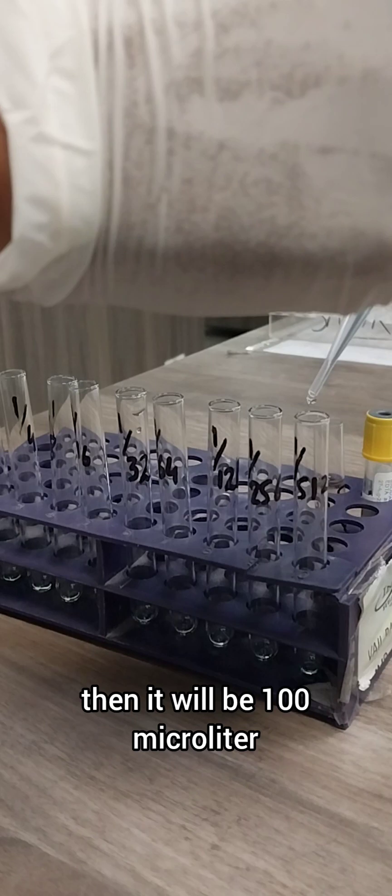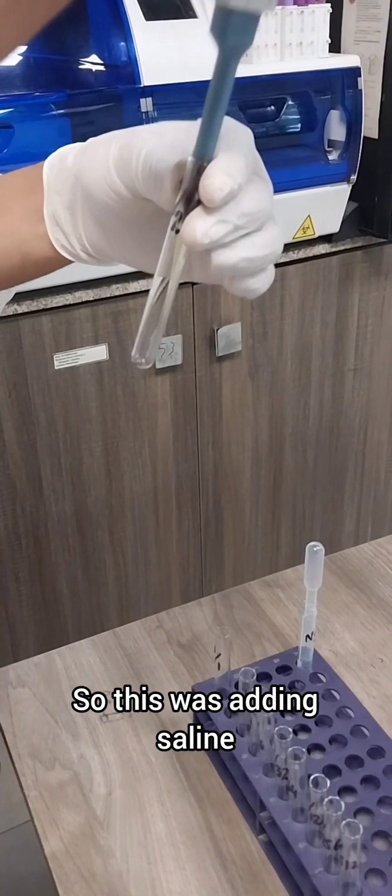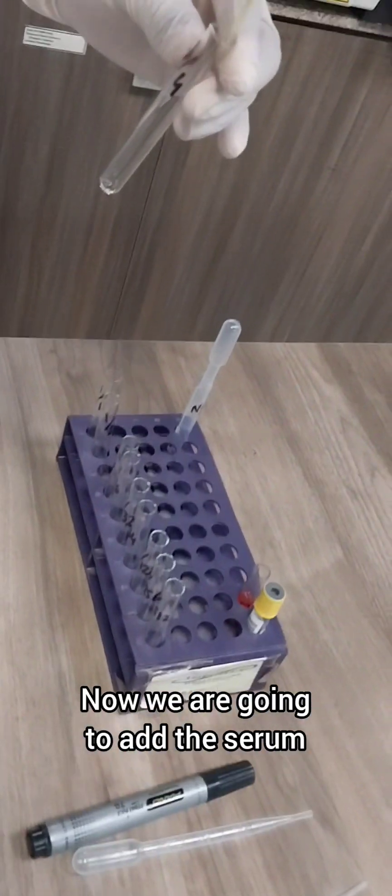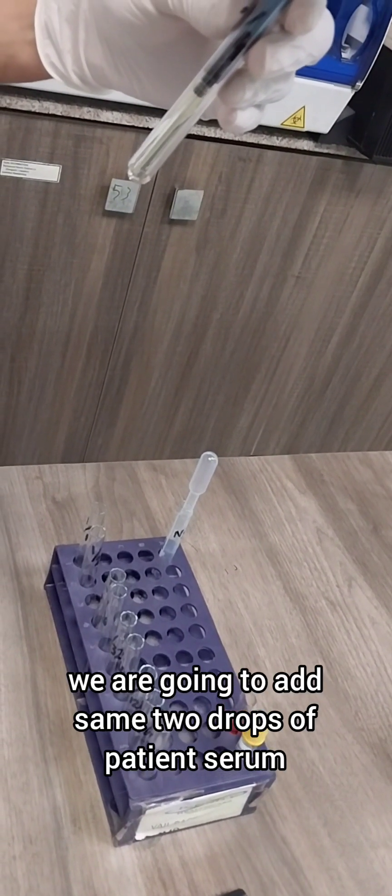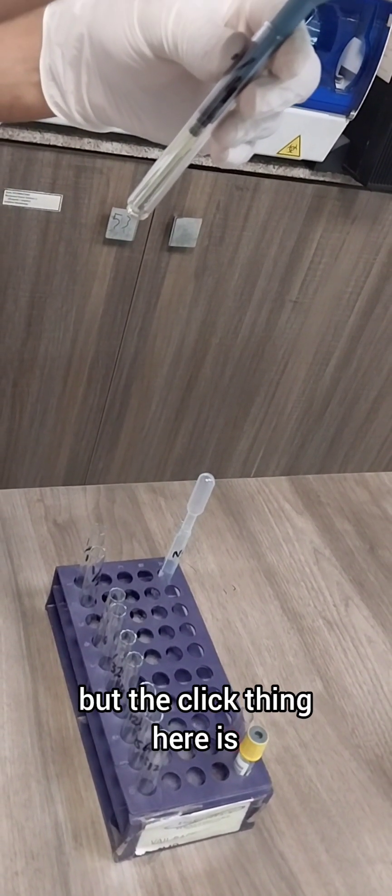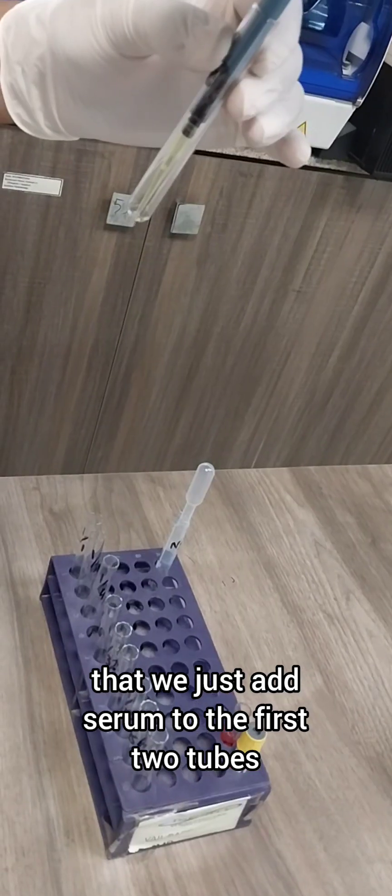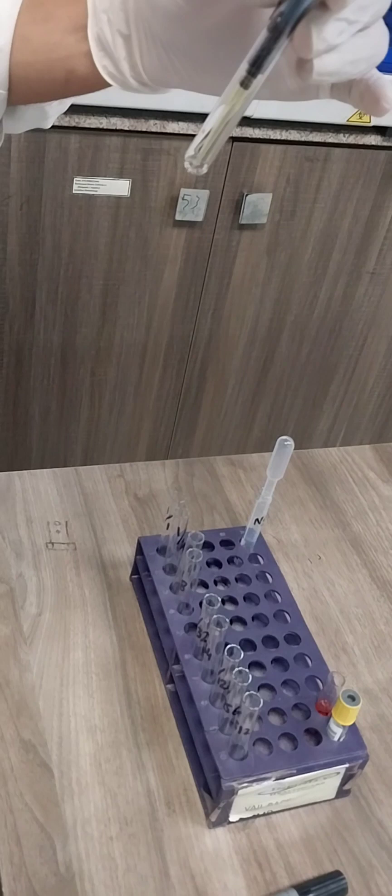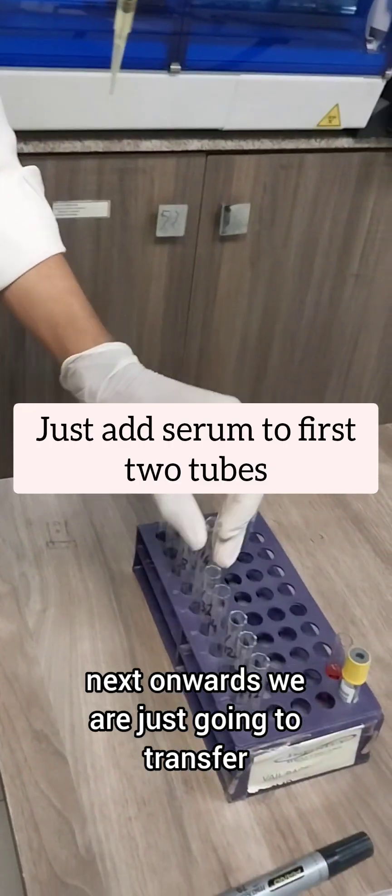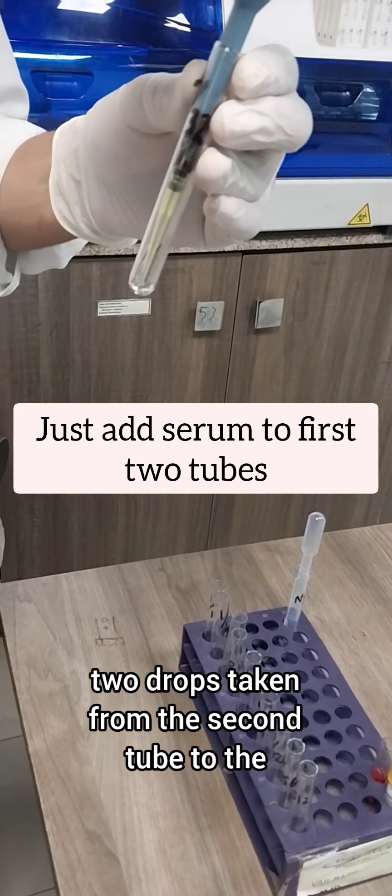If you're using a pipette, then it will be hundred microliters. So this was adding saline. Now we are going to add the serum. We are going to add the same two drops of patient serum, but the trick here is that we just add serum to the first two tubes.